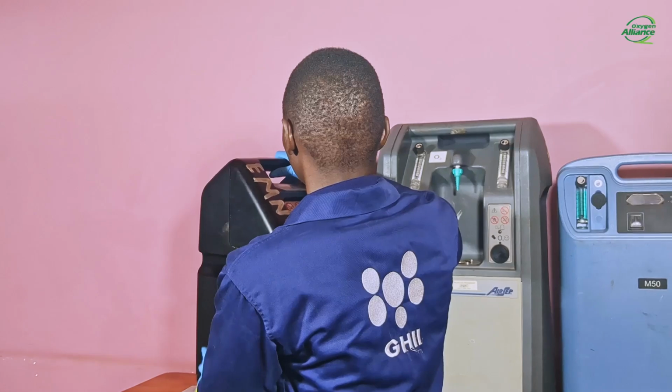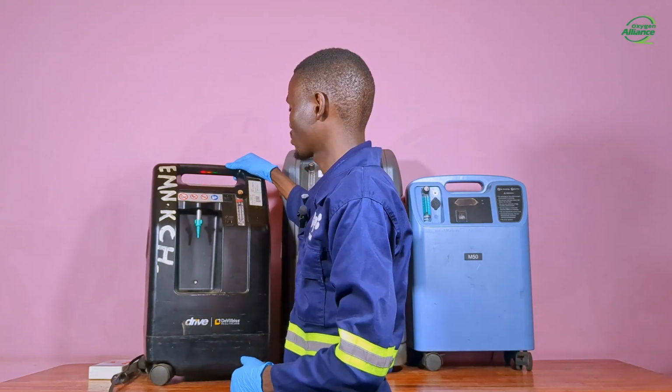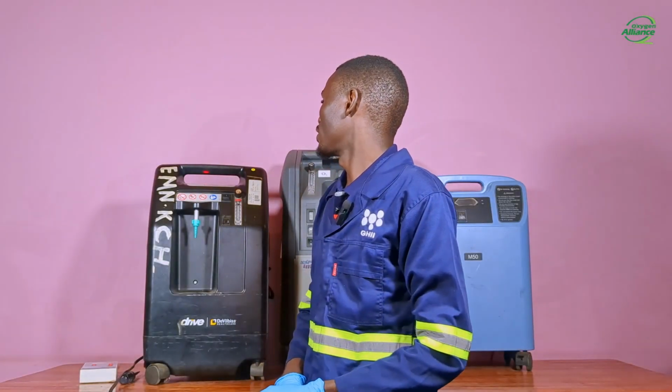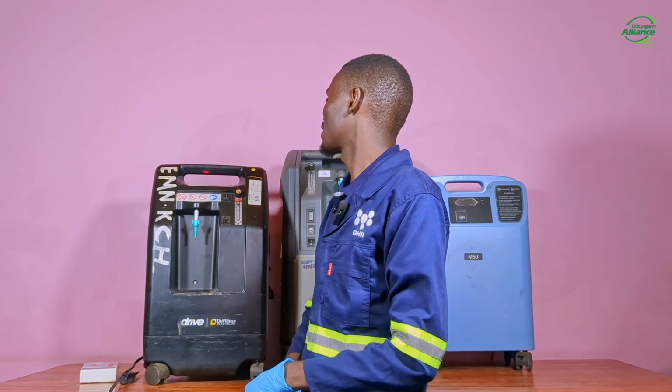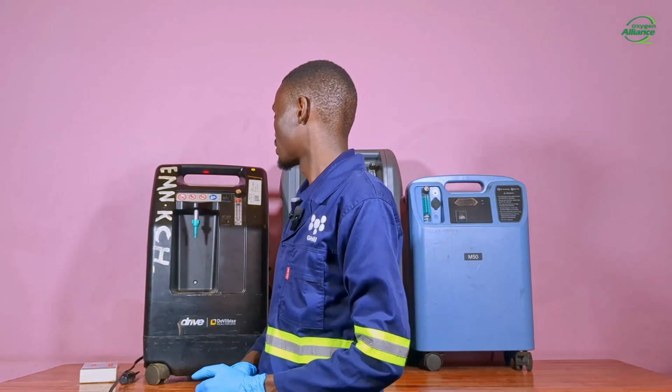Today, I'll make a demonstration of this problem using a DeVilbiss 525 oxygen concentrator, which uses a rotary valve as the control valve. Now, I'll turn on the oxygen concentrator and connect the oxygen analyzer to observe purity readings. I'll wait for at least 5 minutes before I observe the purity readings. As you can see, the oxygen concentrator is showing a service indicator light. So I'll just connect the oxygen analyzer to observe the purity readings.